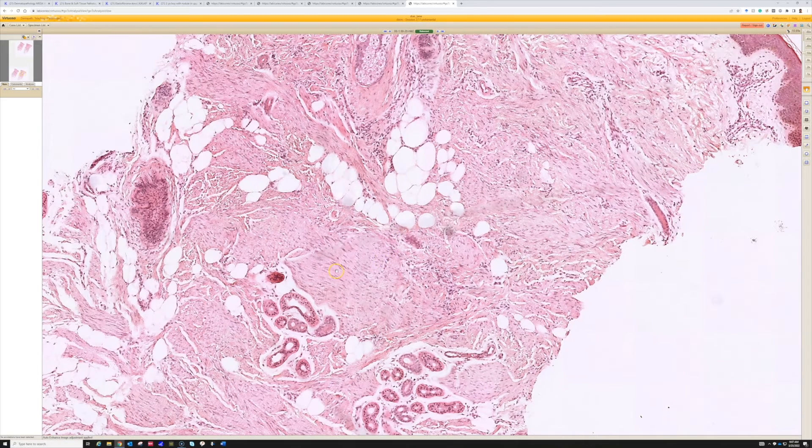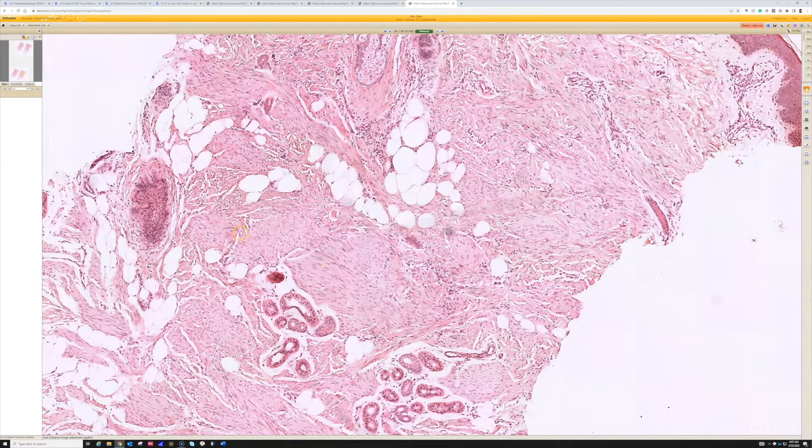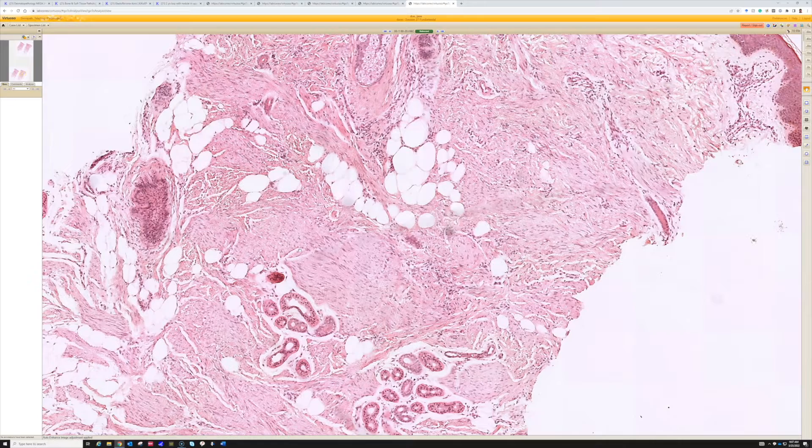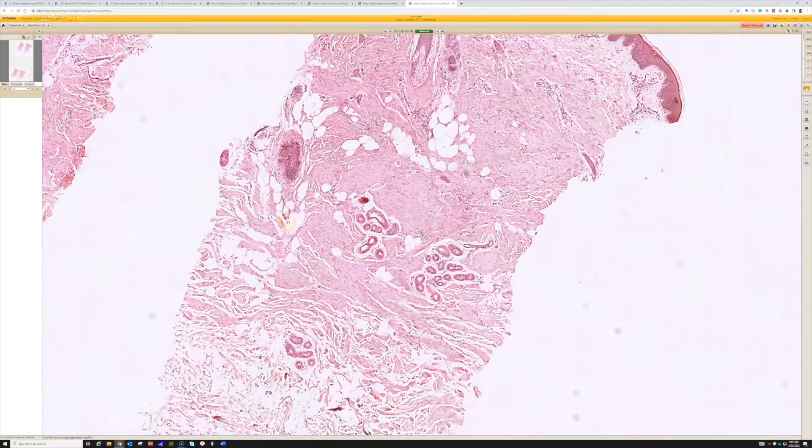So that's the one thing that helps me. If I have CD34 positive and it's going into the fat but has fascicles like this, then it's probably a benign CD34 positive fibroblastic connective tissue nevus. And if you're having trouble, of course, you can do FISH to exclude DFSP.